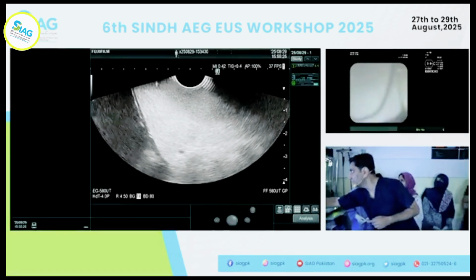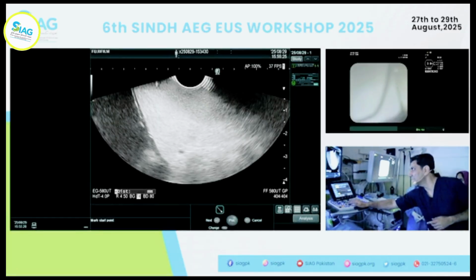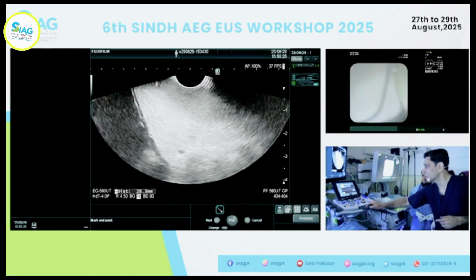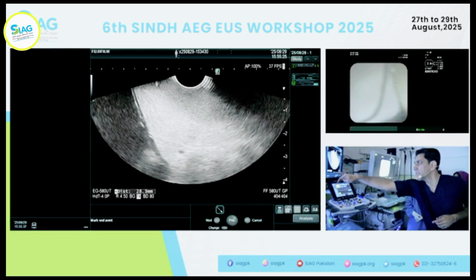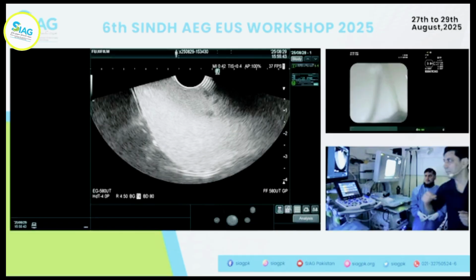So what you want to do is freeze. Obviously we can't see the sheath. Then you want to see the throw. How much throw is that? How much can you safely go? So you can go up to 3 centimeters, and then you can actually lock it there. You measure it. You save it. Okay. Good.